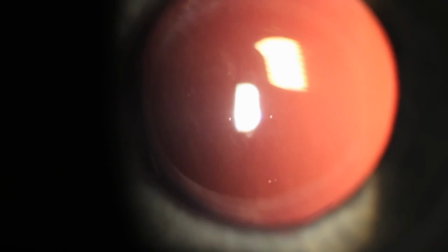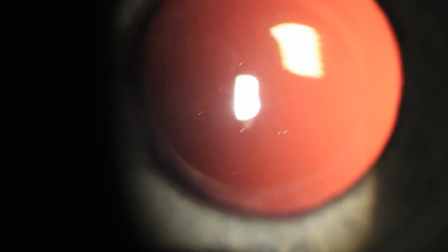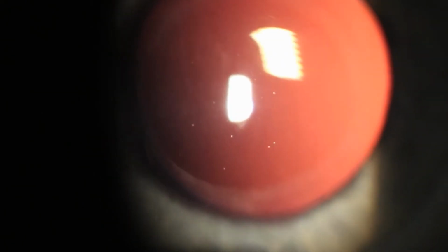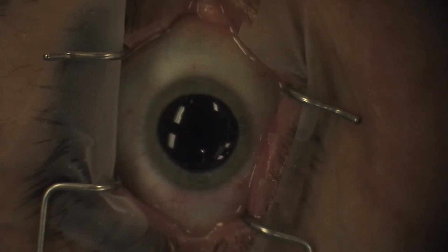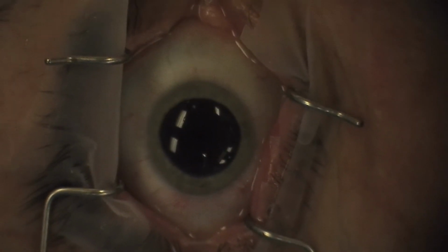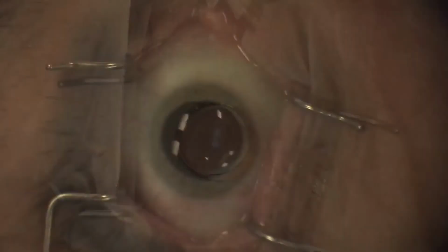You can see the alignment mark inferiorly, and we focus to the alignment marks on the toric lens and back. This lens has rotated approximately 30 degrees. So we bring the patient back to the operating room and we perform an ORA, which confirms that there is about 4 diopters of residual astigmatism.